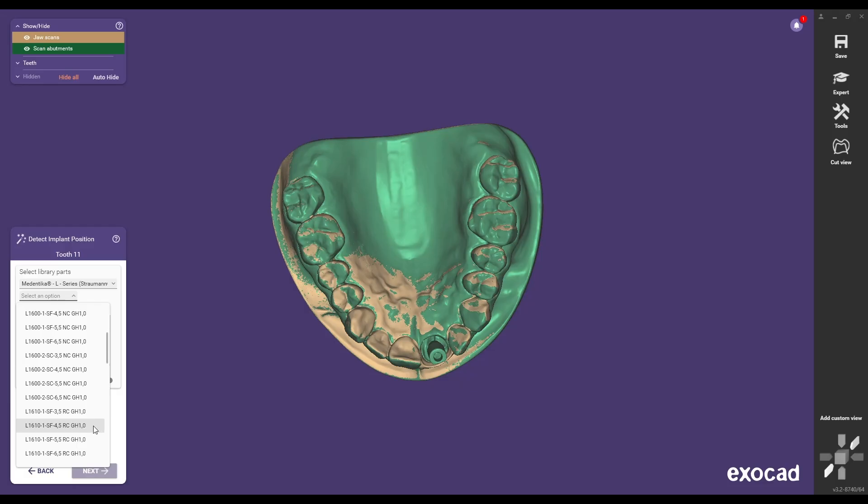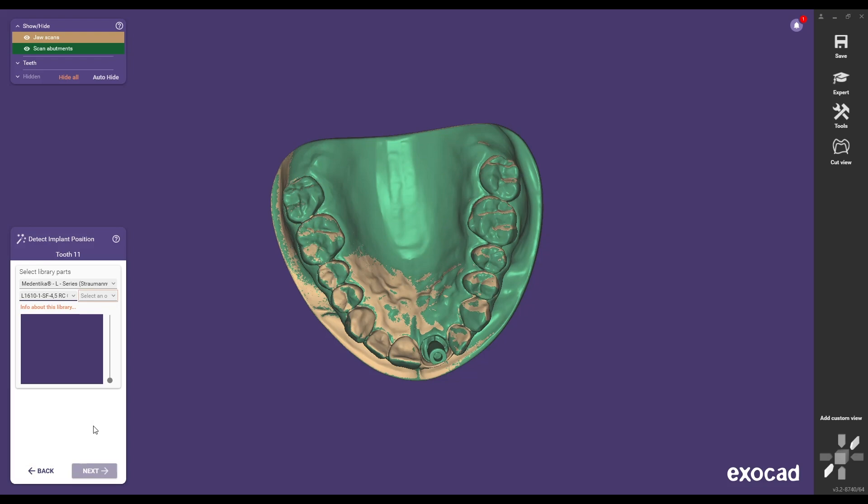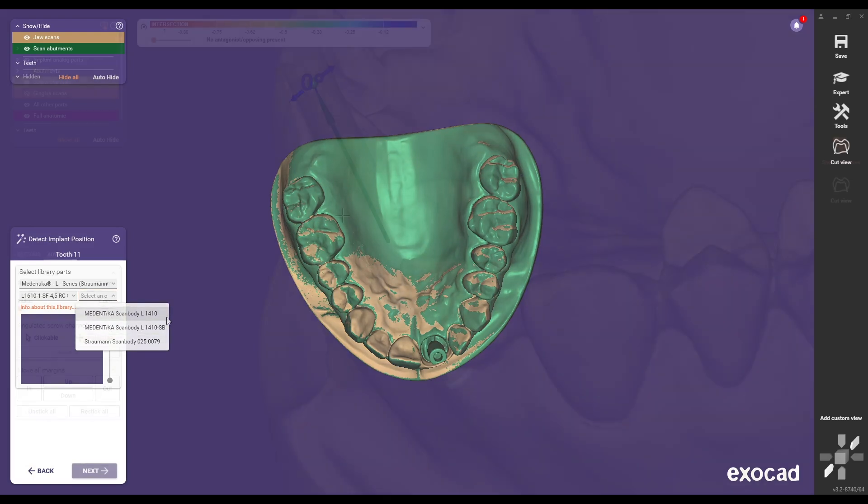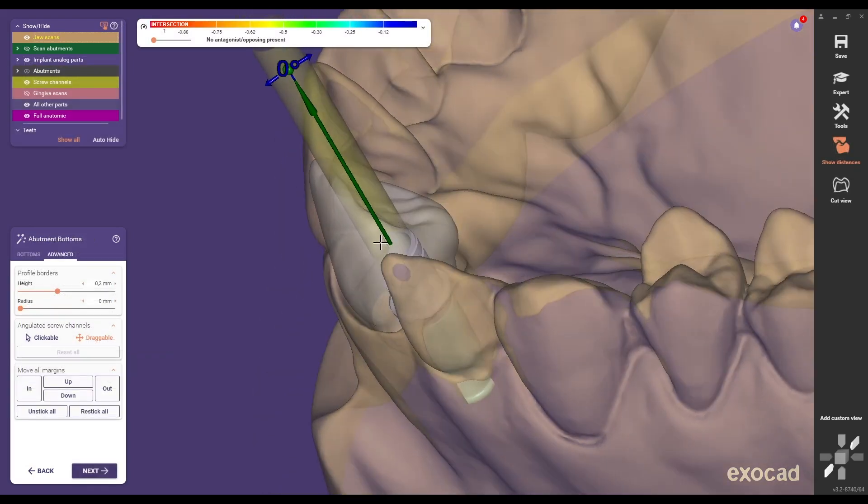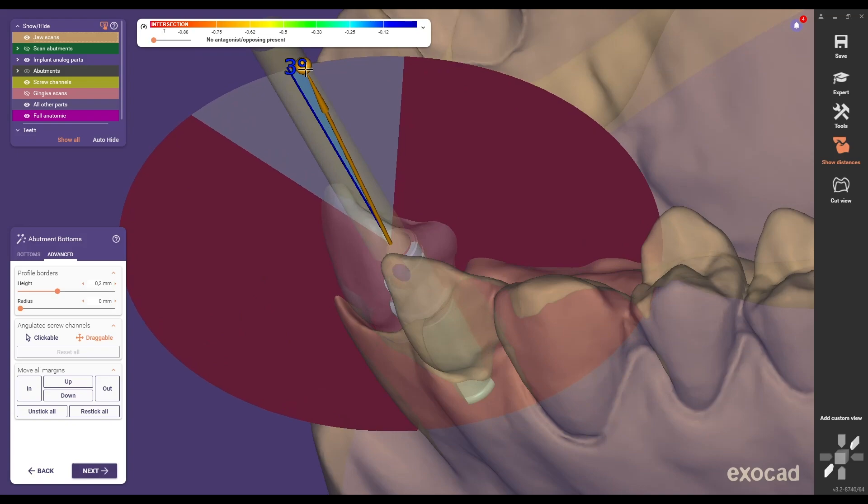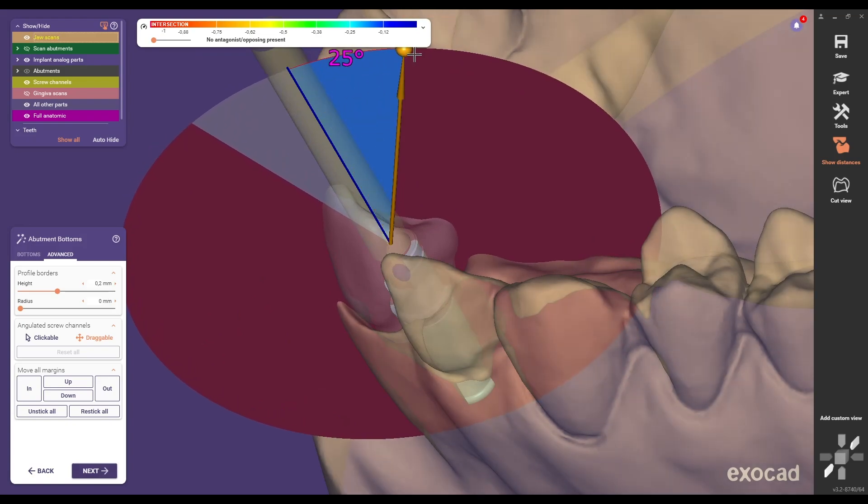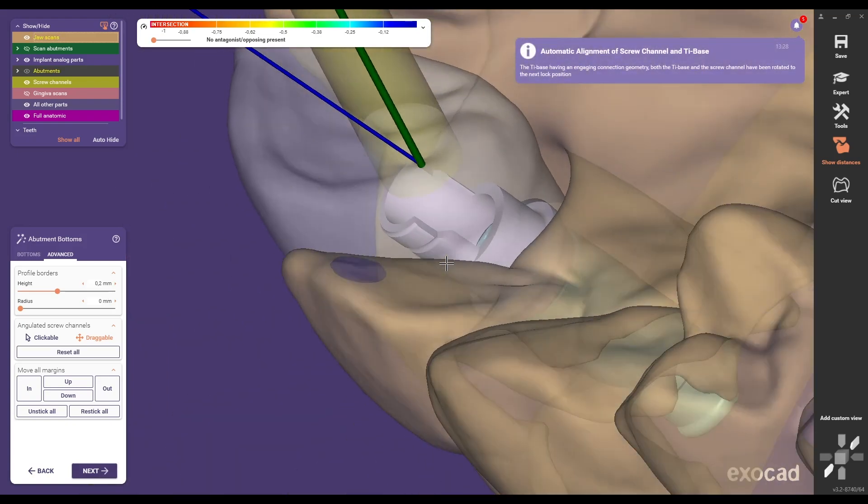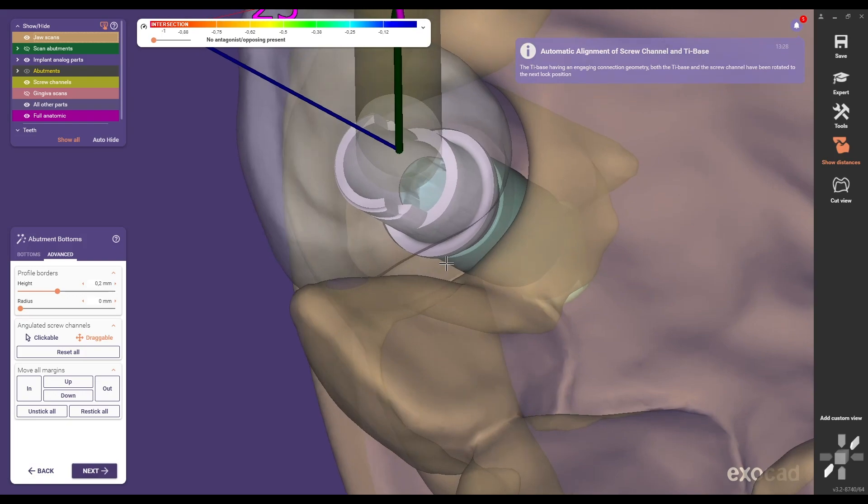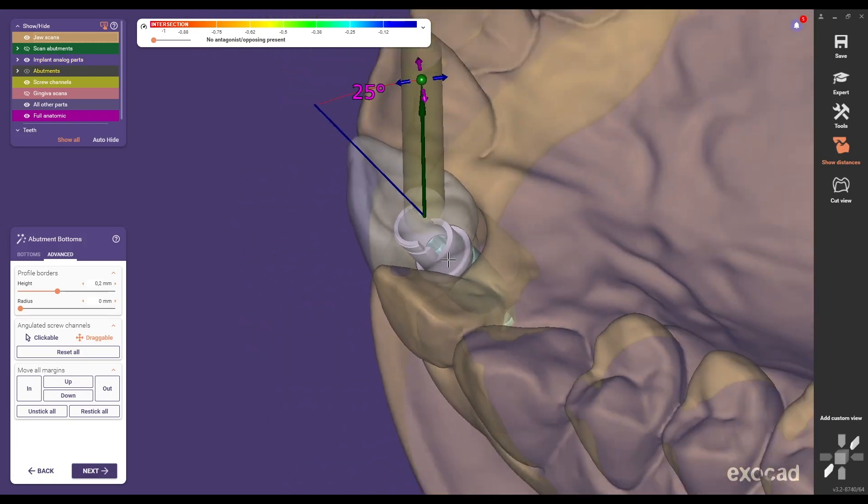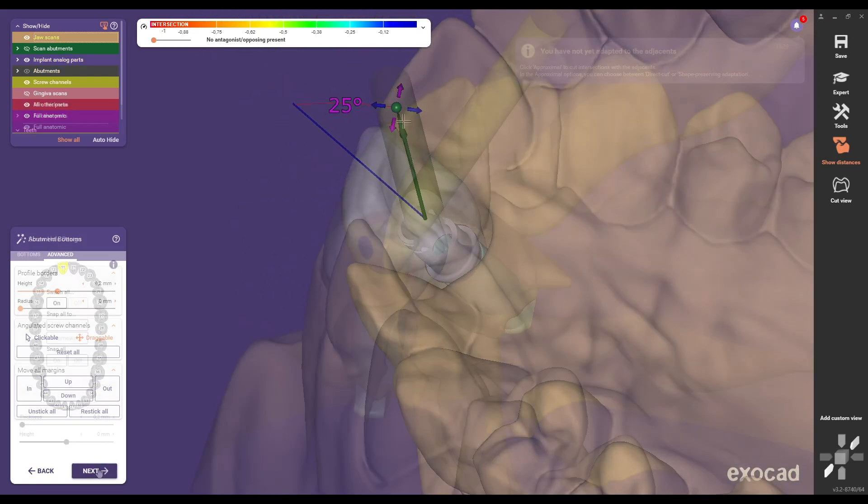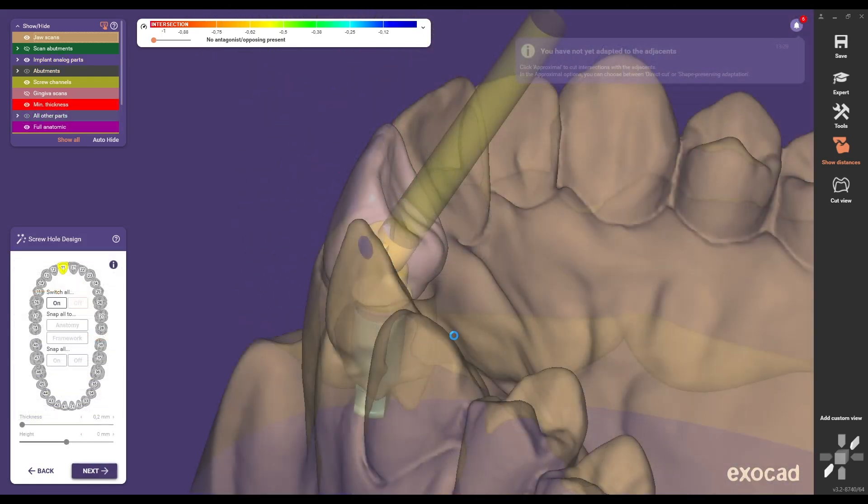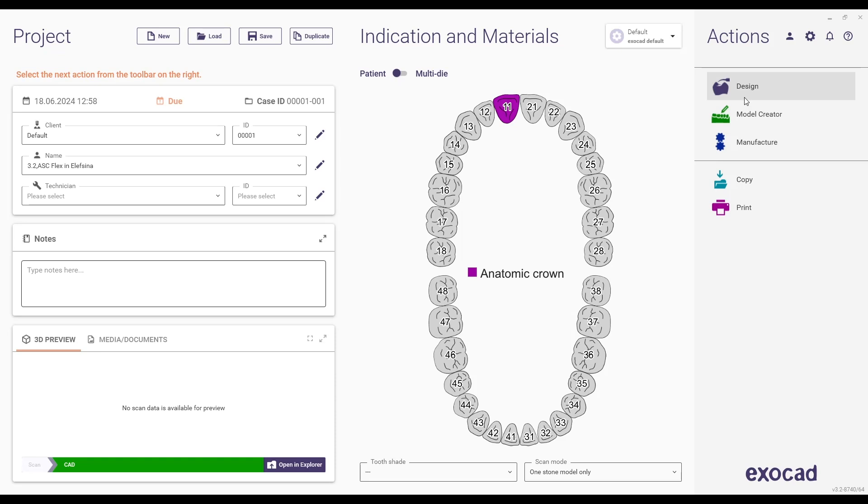Welcome to our release video showcasing the new features for the Titanium Base ASC Flex in ExoCAD Elefcina 3.2. In this video we will demonstrate how to utilize the new angled screw channel feature to ensure a precise and efficient workflow.